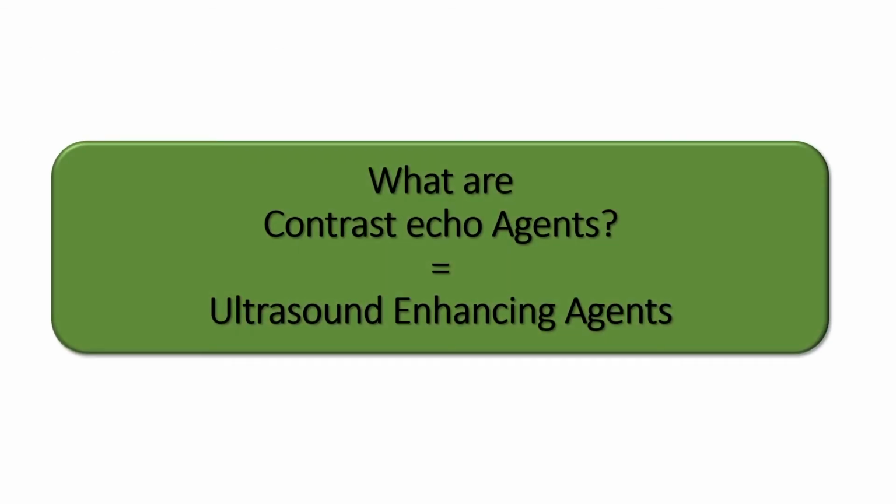What are contrast echo agents? Or, as we're calling them as well, ultrasound enhancing agents. And I'd just like to make a point about why we are using the terminology ultrasound enhancing agents. It's to reduce the confusion really in communications with our patients. When patients hear the word contrast, they often think of radiographic dye that could impact on their kidneys. And so it's important for them to understand that ultrasound contrast agents are different, and the terminology, therefore, ultrasound enhancing agents is what we've chosen to use.